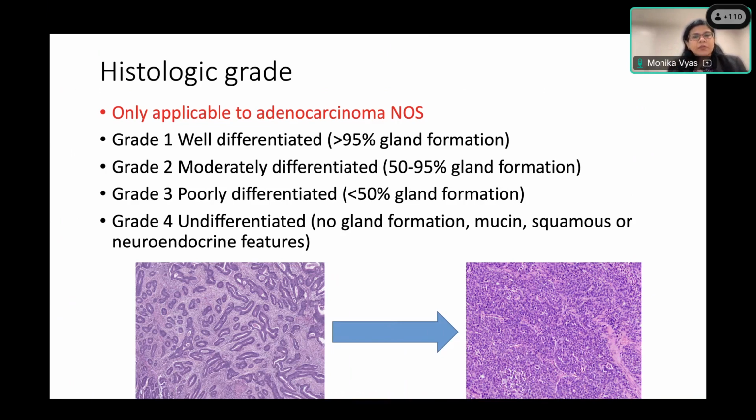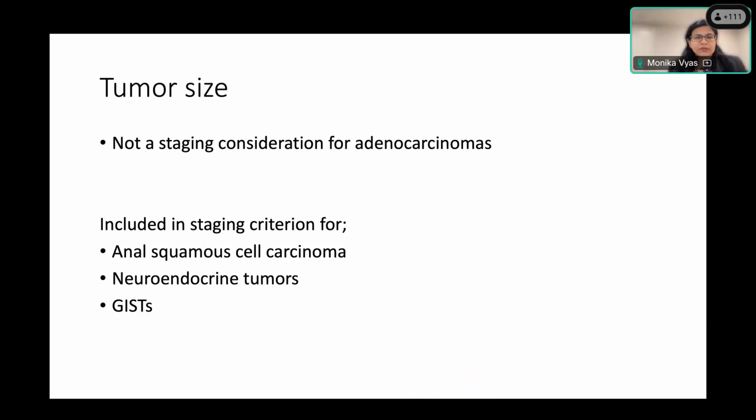Now, if you see poorly differentiated features focally in a well-differentiated neoplasm, especially in a local resection specimen, I would still mention that there is focal either high tumor budding or poorly differentiated clusters, because that could impact the decision making depending on other parameters taken together. So it's always a good idea to mention any poor prognostic factors that you're seeing in the case.